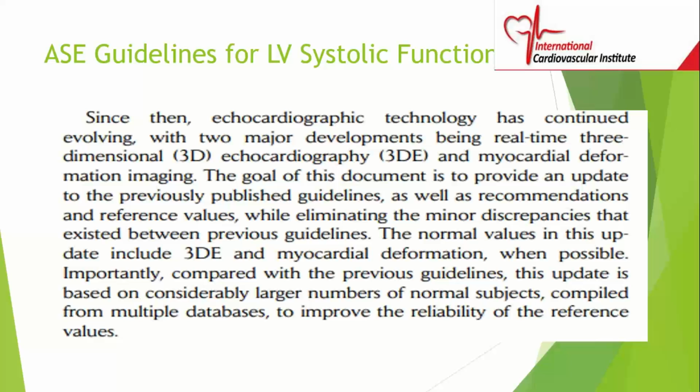Since the 2005 document, echo technology has continued to evolve, with the two major developments being real-time three-dimensional echo, which is fairly standard in some institutions now, and myocardial deformation imaging, which is what we call strain rate and velocity.